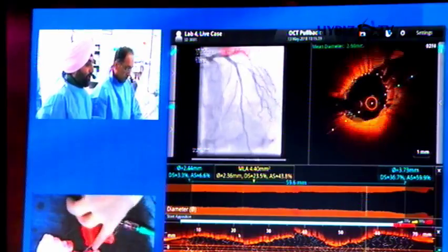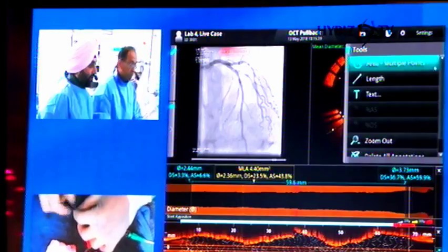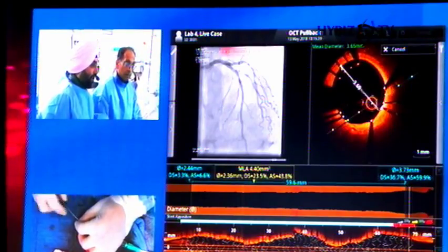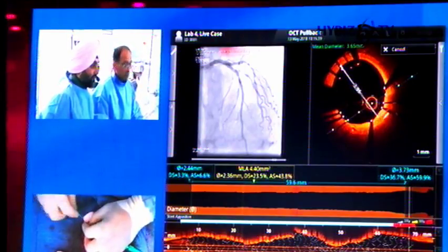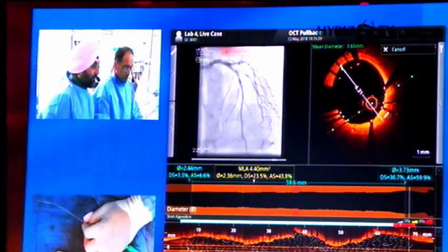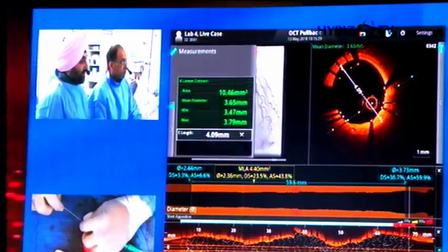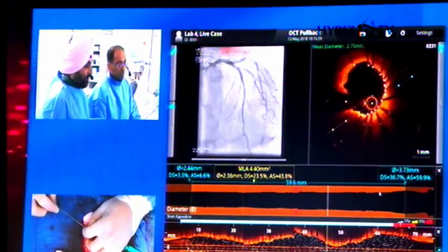So I'm just going to go back to the top end here now. Sorry, a message from the floor? There was a comment just about MLA. Yeah, it's just in that one area, it looks like the MLA is a little bit small, but I can't tell if that's just that one area or uniform. And I think you're talking just around about here.